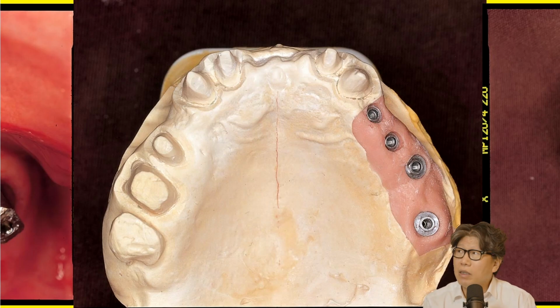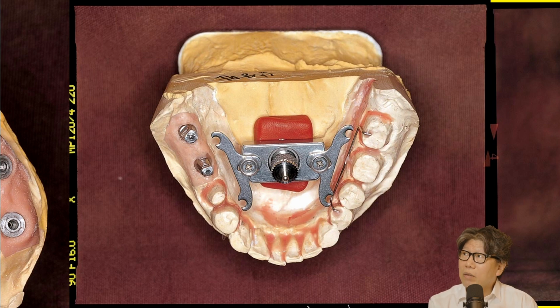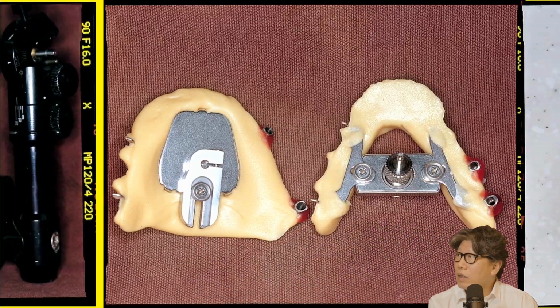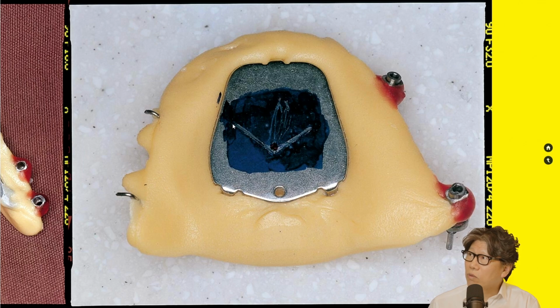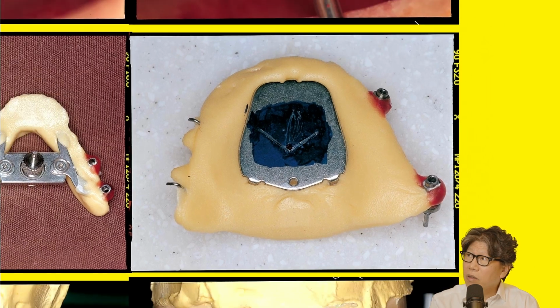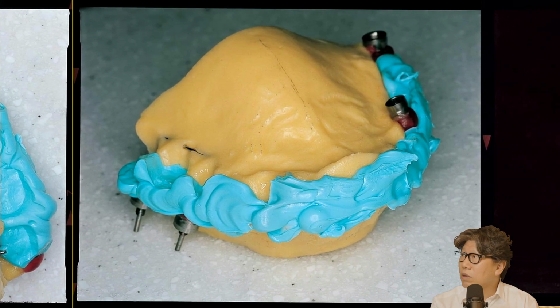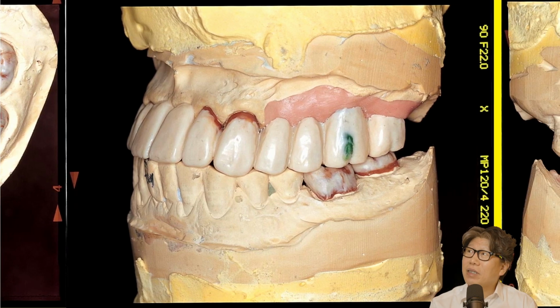And then I used a lot of Gothic arch tracing, because if you don't have full mouth rehabilitation, you're really limited in your treatment. So I would trace the Gothic arch, mount the model, and trace it like this, and it would come out clean. Protrusion, laterotrusion, it all comes out fine. So the TMJ is fine. So I'll take the bite registration out of the mouth, and then I'll do the model mounting, and then I make the prosthesis.